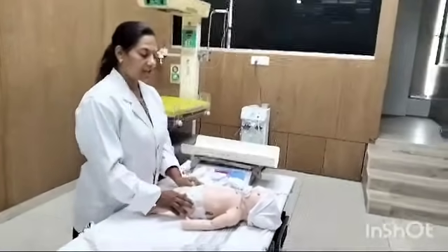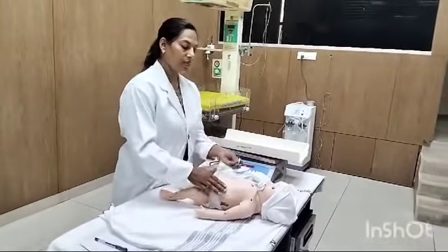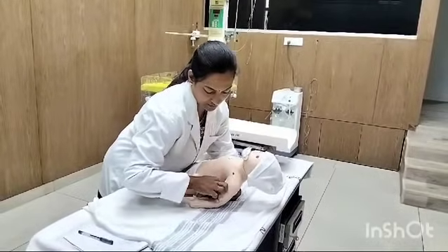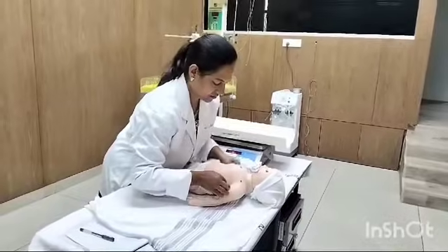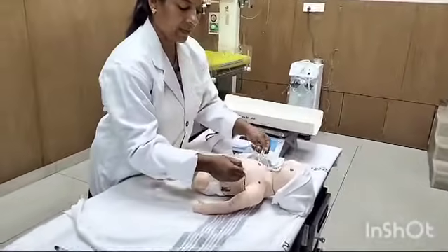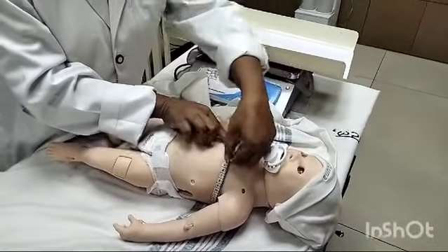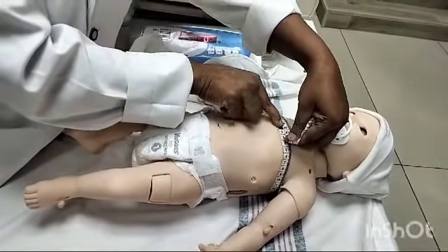After the head circumference, now we will check the chest circumference of the baby. Take the measuring tape around the chest, above the nipples, and here we will get the chest circumference of the baby.